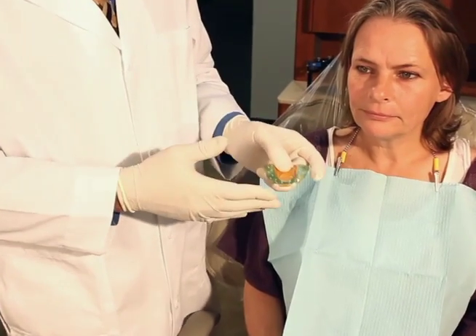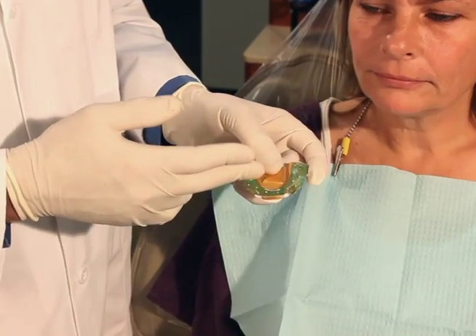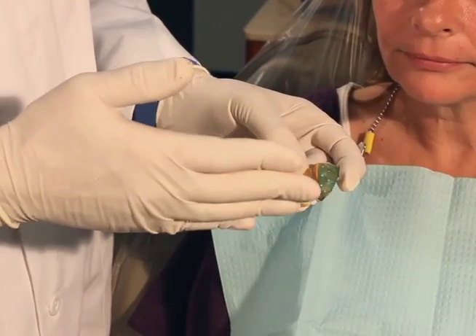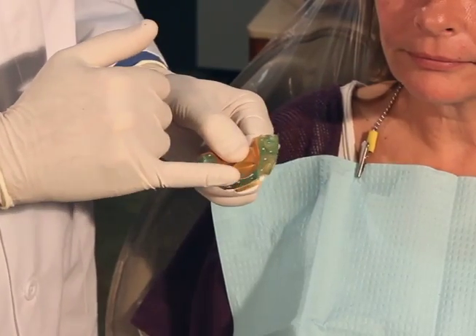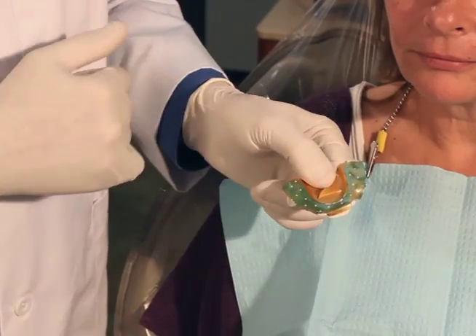We're going to do a protrusive — actually I'm going to do both. I'm going to have her retrude and go into an eccentric index, then open, come forward until it's edge to edge and have her bite up into edge-to-edge position. This will indicate that that particular tray is a protrusive record versus the one that only has one index, which is our centric record.